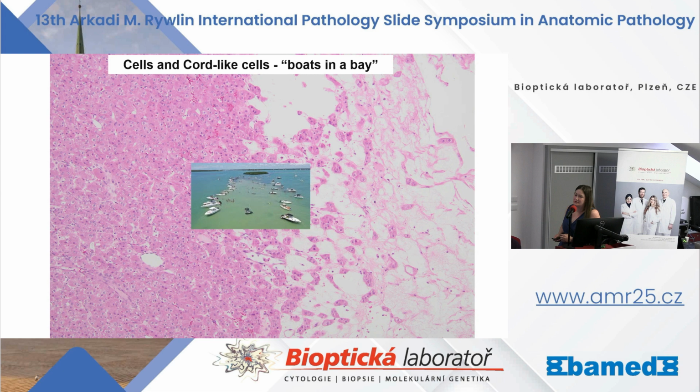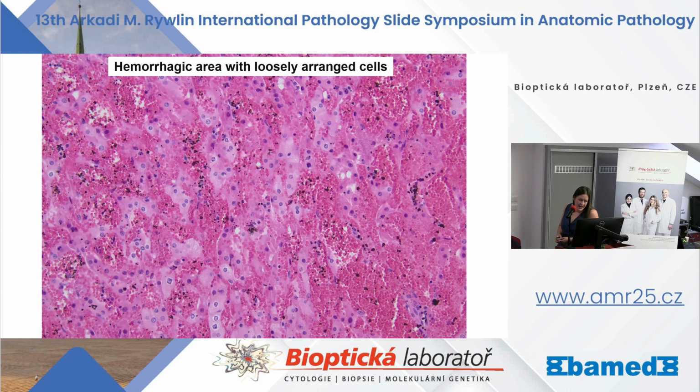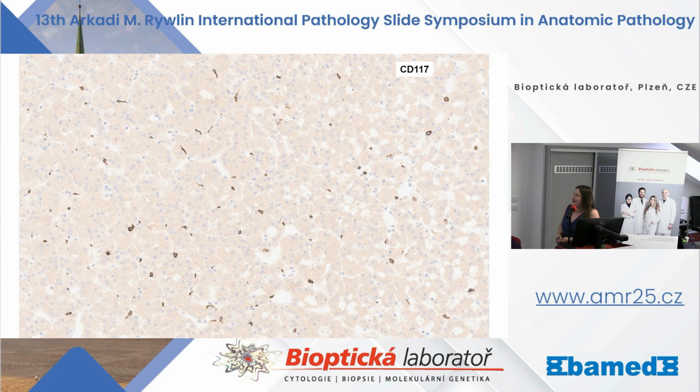And this is absolutely the most characteristic pattern of growth for this tumor. Here you can see the hemorrhagic area. Again, there are trabeculae, there is no nested architecture nor tubular structures. Again, one detail for a hemorrhagic area. And I think, again, the diagnosis of this tumor is made from hematoxylin eosin slides.